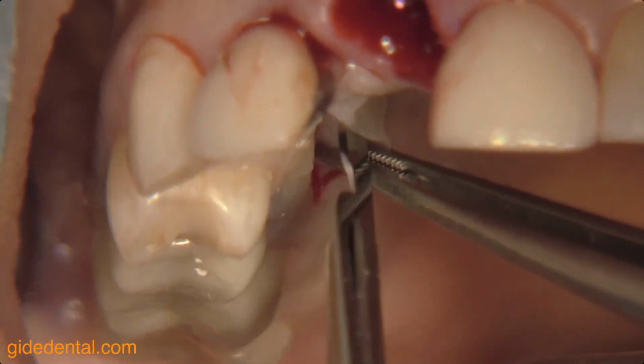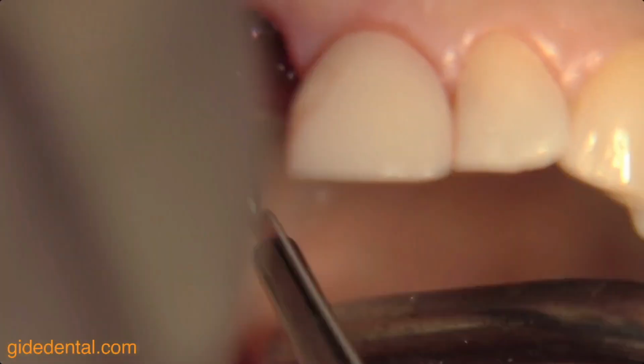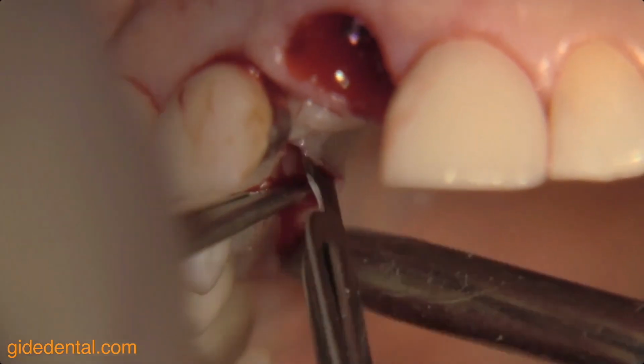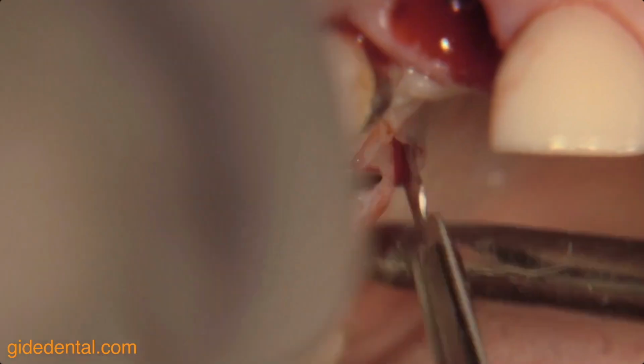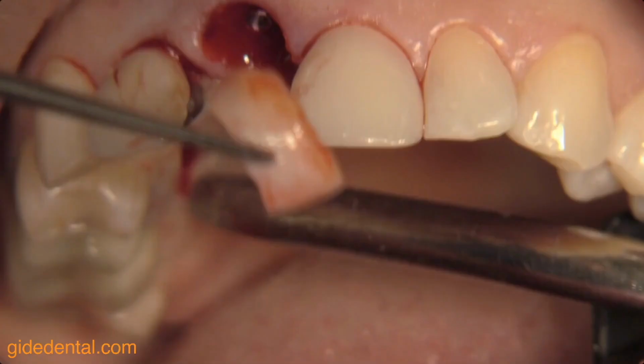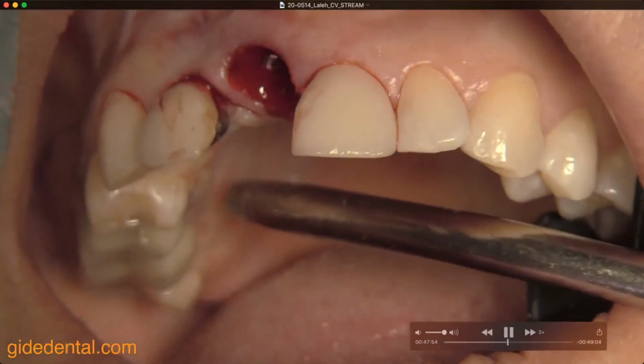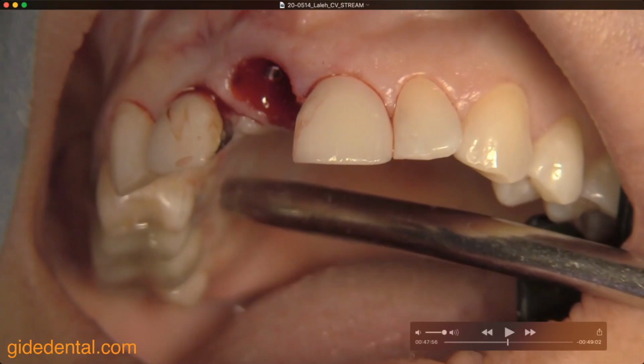So I'm basically using the typical periodontal plastic surgical approach of a subepithelial connective tissue graft. And I'm staying away from the periosteum. I'm staying away from the bone because that's also where, of course, more nerve and more soft tissues are, which are bleeding.